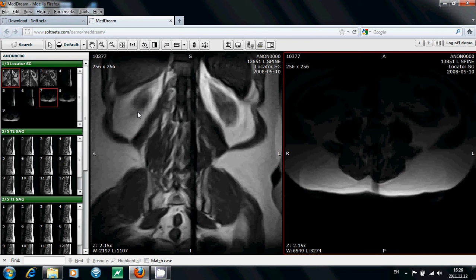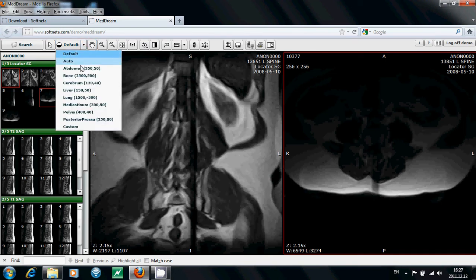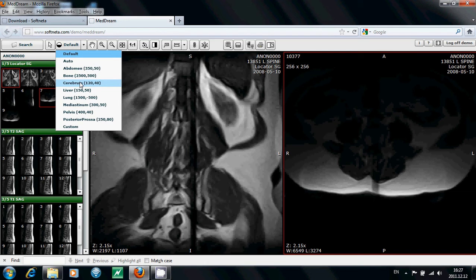You can manage and analyze the study images according to the criteria you need. First one is windowing. It is used to adjust the level contrast of the image.